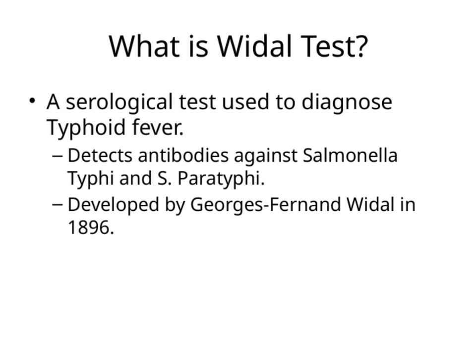When we ask, what is the WIDAL test? We're really talking about a method that helps us identify whether someone has been exposed to these bacteria by checking for specific antibodies. It's a significant tool in the diagnostic process, especially in areas where typhoid is common. This test forms part of the broader theme of how we detect and confirm infections through serological methods, which are crucial for timely and accurate diagnosis.